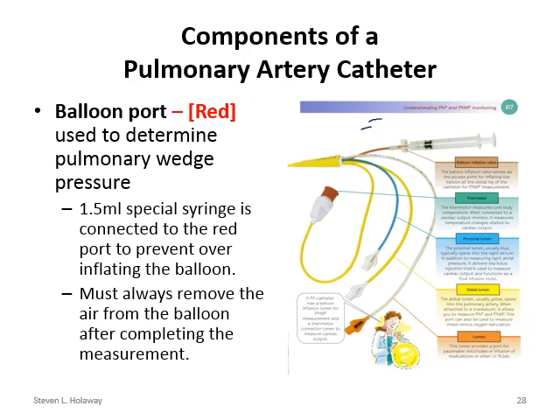Now, the other thing that can happen is sometimes when they do a wedge, you take the air out and you don't see a change in the waveform. When you put the air in, you should see a change in the waveform of these patients, and you want to see what's called a wedge waveform.